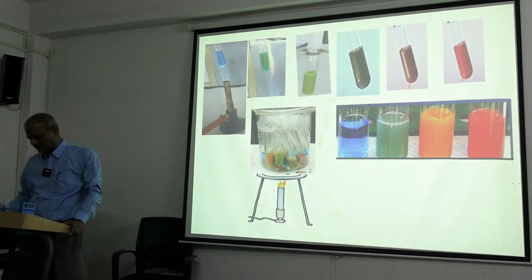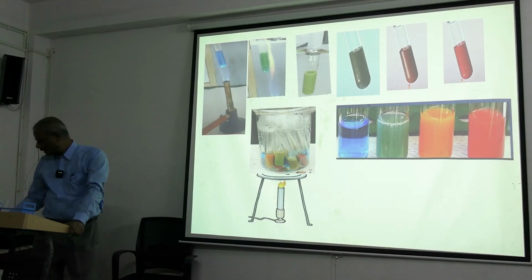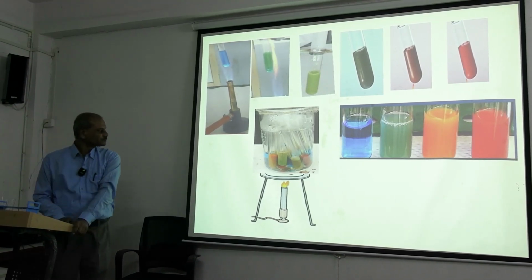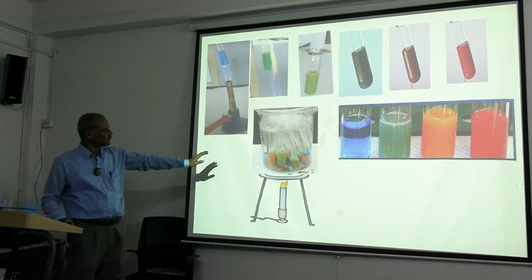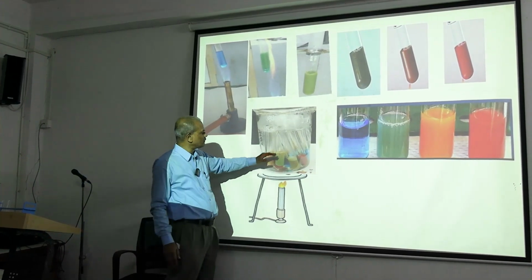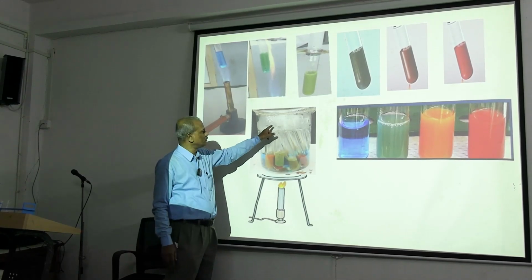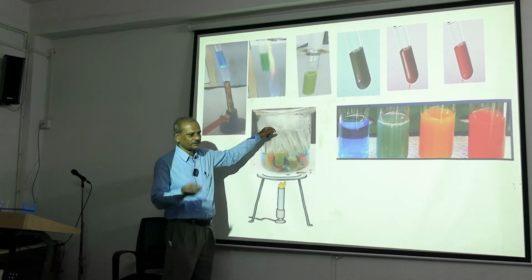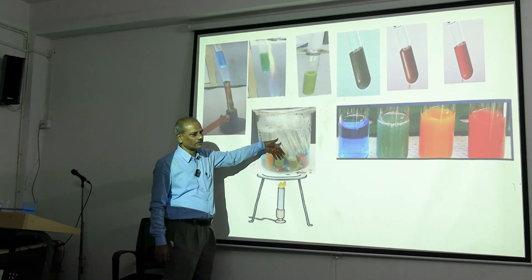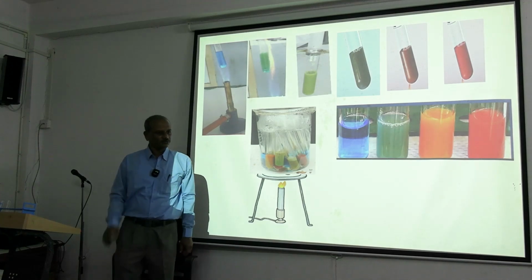Benedict's test is called a qualitative test. Actually, it is not a qualitative test; it is semi-quantitative. Why am I saying this? In our laboratory in earlier days, when the dipstick was not available, we used to collect the material from the patients and give numbers to the test tubes for each patient. We used to put them in the boiling water bath, and you can see the different shades of color. Then accordingly we used to report it.